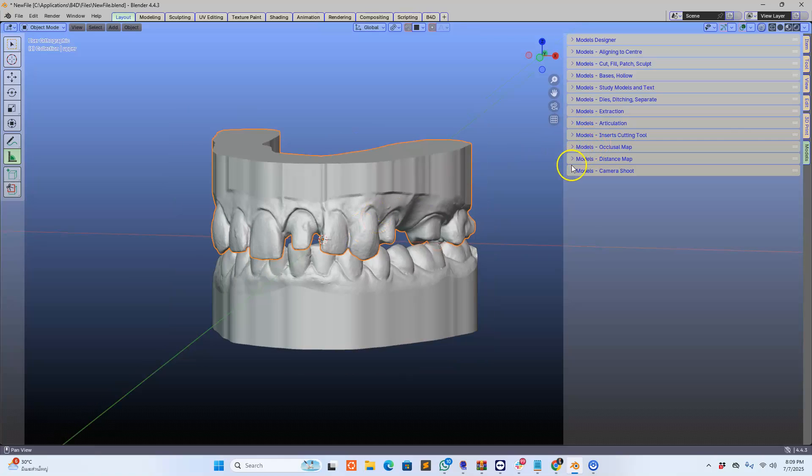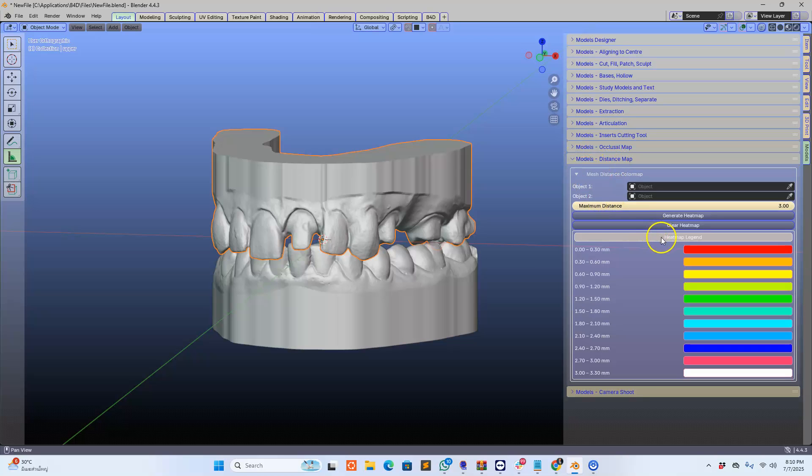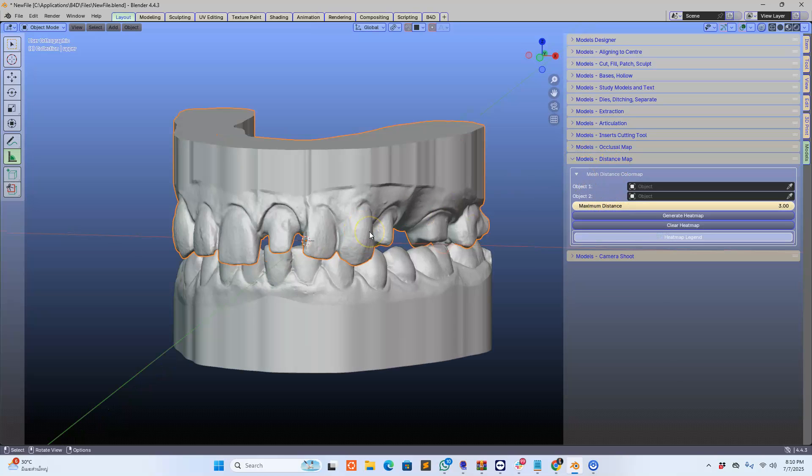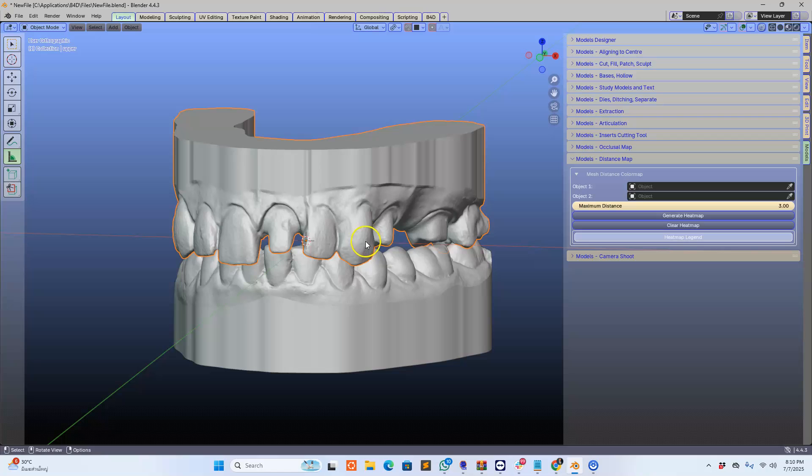In the model designer, we're going to have another menu button. It's a distance map for accurate measurement. Let me show you how this works.